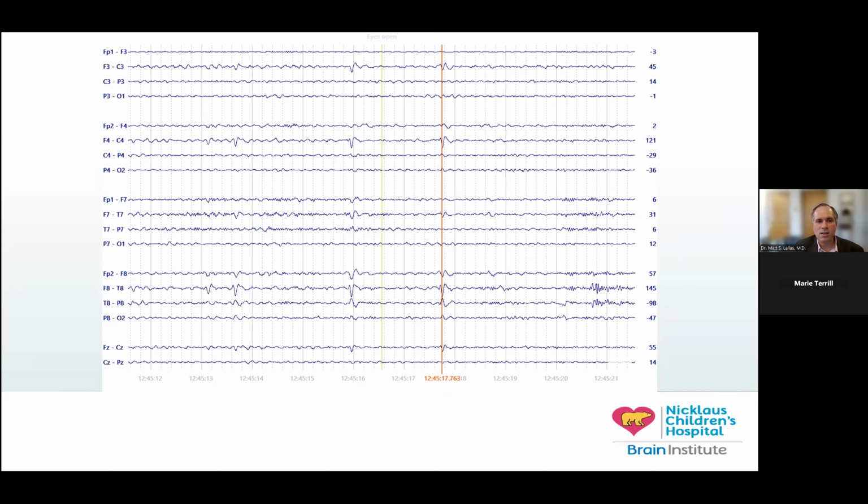So this is an EEG for a patient, and I'm sure that most people looking at it have already noticed that it's a bipolar derivation. If they looked at the montage, they'd know that I put the parasagittal chains on top and the temporal chains below. Some people might be saying, I really want the right side to be red and the left side to be blue. It's just how I look at EEG. I personally like all the lines to be the same color, because I think color adds visual information otherwise. But people read it the way they read it.